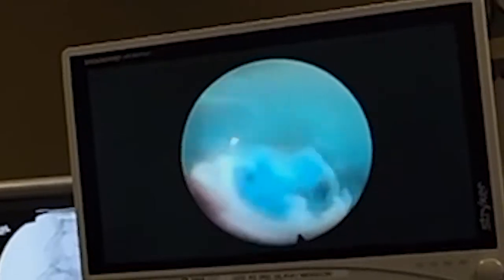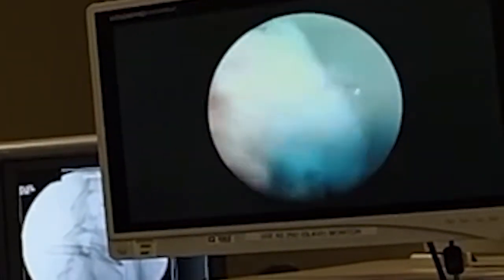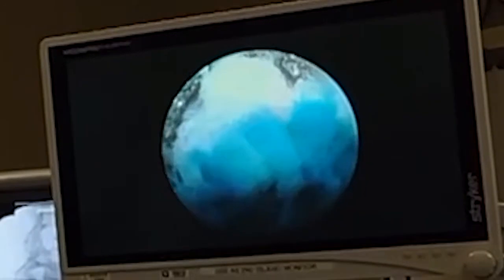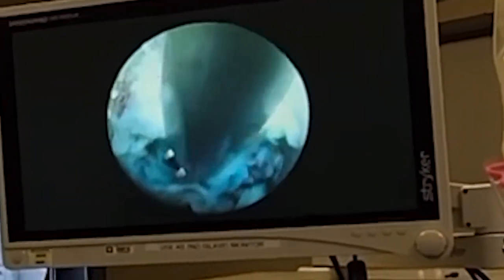Okay, I'm using the tongue of the cannula to pimple pop the disc herniation. I wouldn't be surprised if it comes flying out like a hot pimple. I know that's gross, but still. Oh, this is going to feel so good. If you don't wake up feeling better, I will eat my hat. But just like the rest of you, it's not going to come out without a fight. I can already tell. It's going to be like a little troublemaking teenage kid. I'm excited.